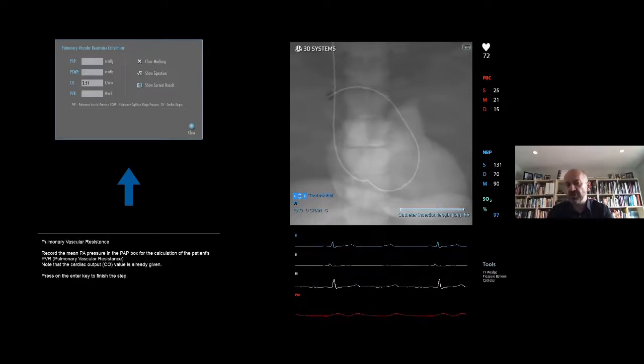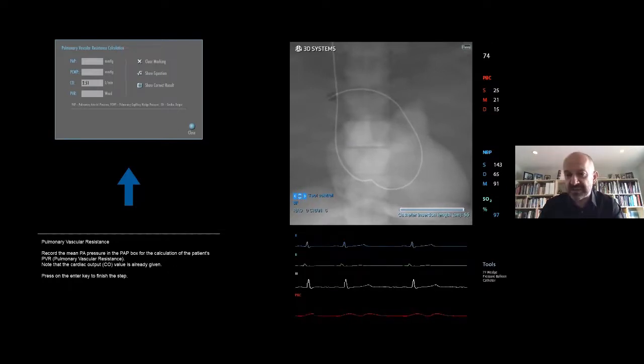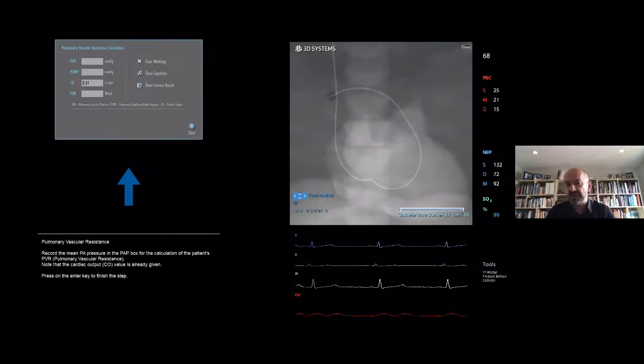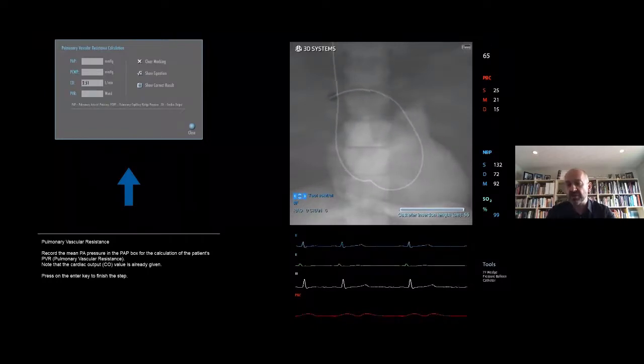Extremely important: you don't know where you're at because you don't see the fluoroscopy, all you see is the pressure tracing. So you watch the pressure tracing after the pulmonary artery pressure is obtained to get the wedge, and then you note the distance. You see about 55 centimeters. That is quite generous. It could be less. It could be 40. It could be 60. But note that pressure, and note the distance. You have to document the distance in the chart because nurses will change, doctors will change. You need to know where you wedge the catheter.